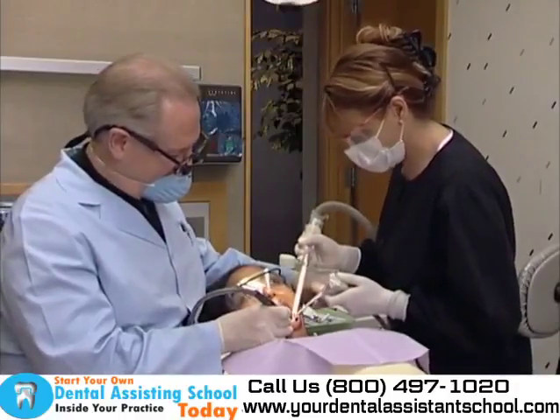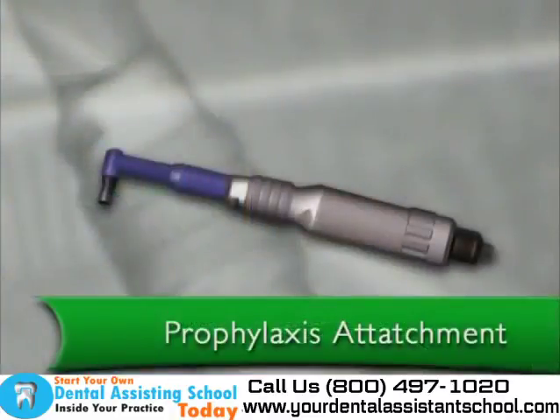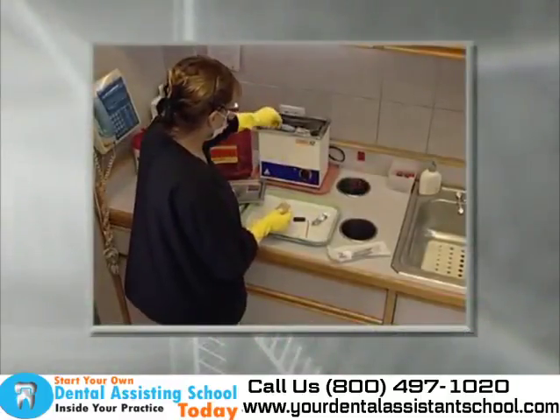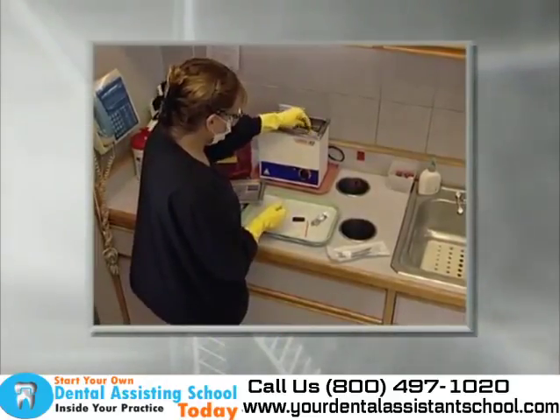The slow-speed handpiece utilizes several different attachments. The attachments include a prophylaxis angle, which aids in polishing teeth, a contra angle, which allows for greater access range in the oral cavity and can hold burrs for removal of decay or polishing restorations, and a straight attachment, which is utilized in laboratory procedures. Conventional speed handpiece attachments used intraorally must be disposed of or sterilized between patients.